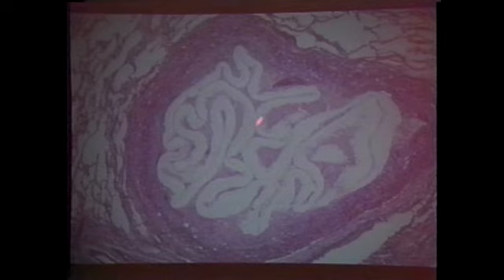Here is a Coenurus, which is just like a Cysticercus, except it has more than one scolex. And here is the bladder, and here are the multiple scolices. And this is a hydatid cyst with daughter cysts and protoscolices, and a very nice laminated thick wall in one of the types. Sometimes it's very old. This is a pig lung, and you find this laminated structure in the lung, and you diagnose it as an old cyst wall of Echinococcus.